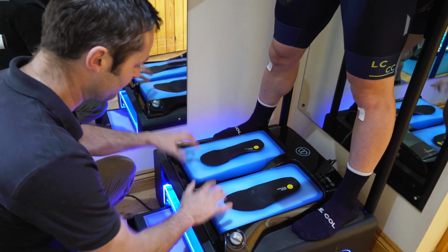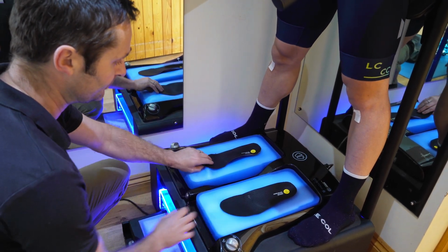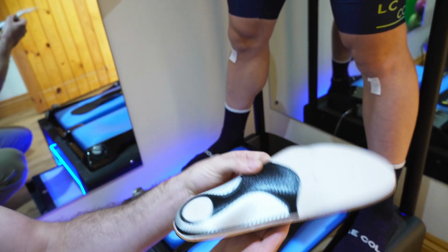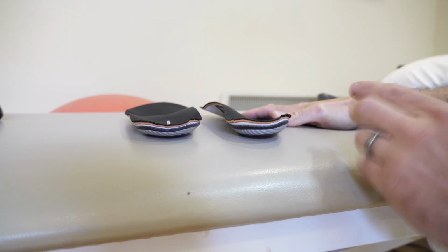So I've just released the air from the mouldings, and that's popped the orthotic out, and you'll end up with basically a carbon fibre shaped piece which goes in the shoe, and that is the same shape as Chris's foot.